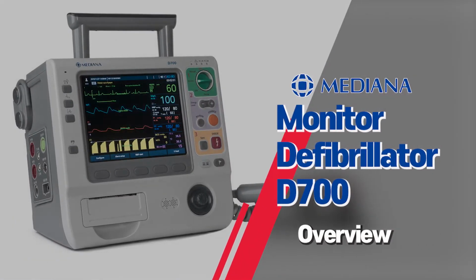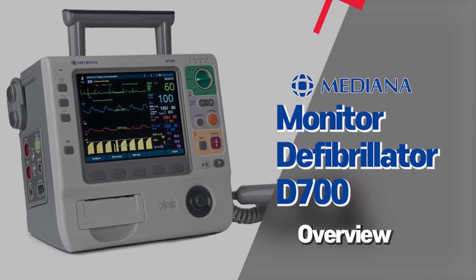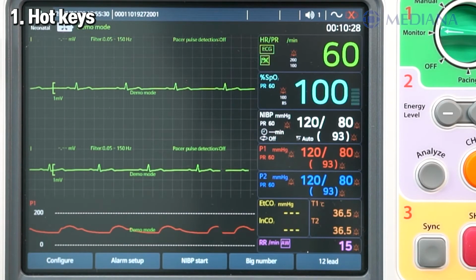This video is an overview of Monitor Defibrillator D700. Here is the front panel of D700, centering on the central LCD monitor.